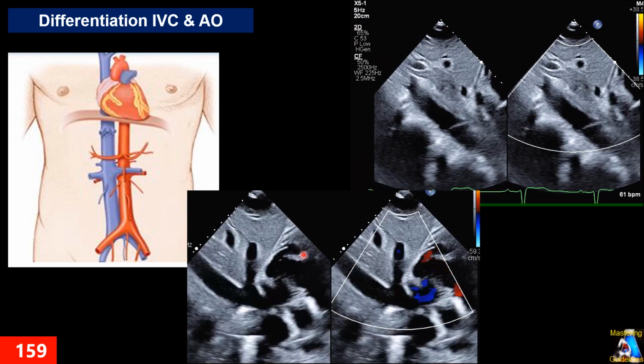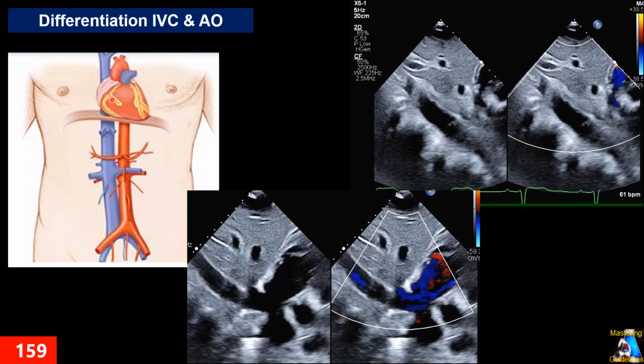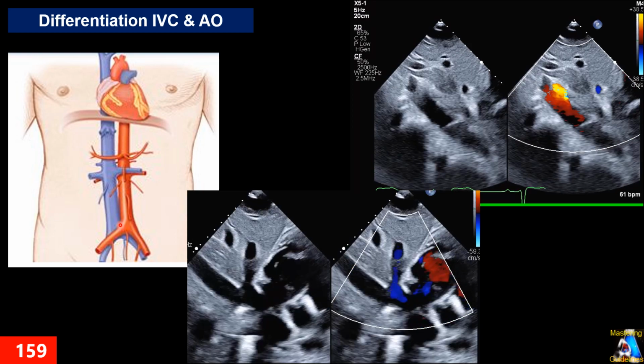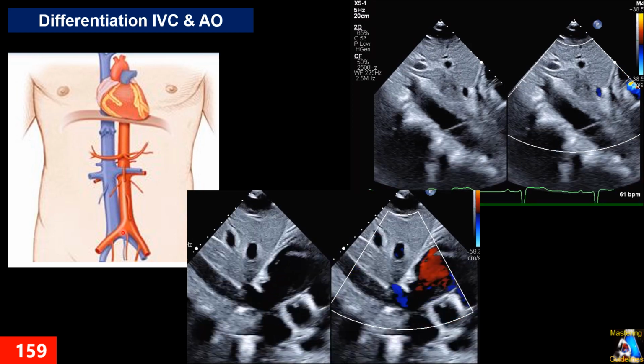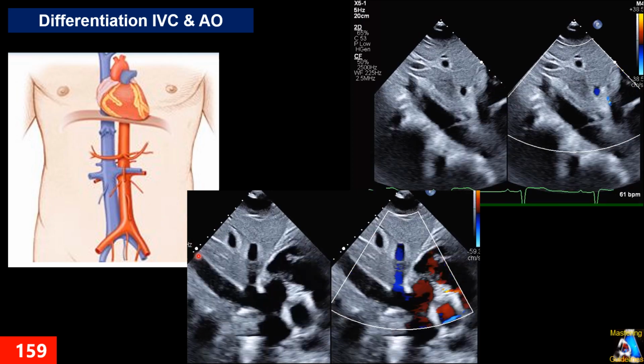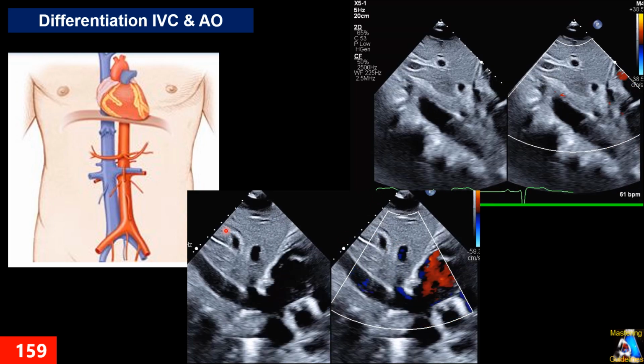One more thing I have to mention: if you want to see more distal IVC, just angle the tip of the probe toward the foot of the patient, or by toeing the probe, you can see more distal of any vessel, IVC or aorta.